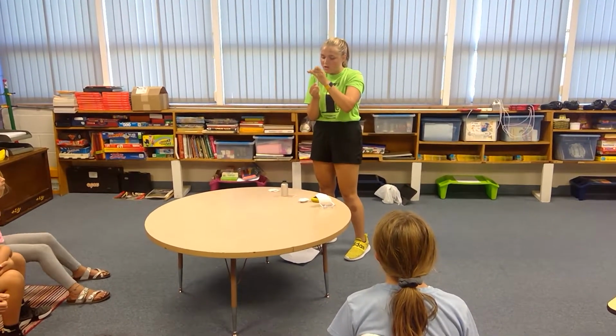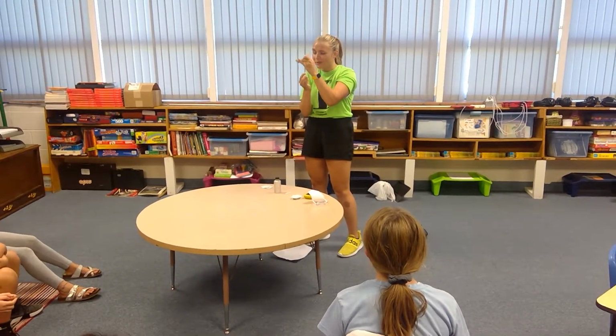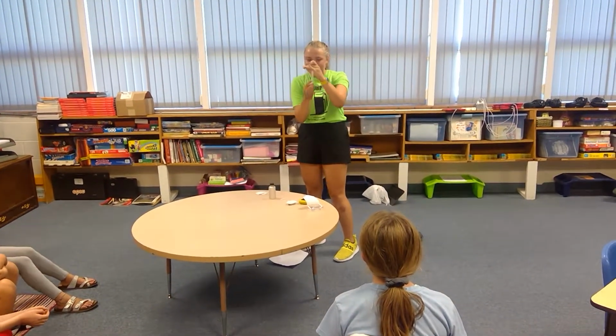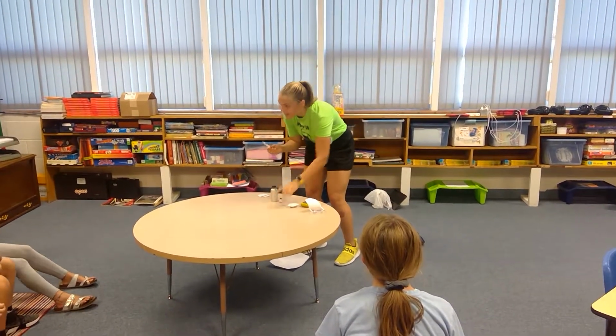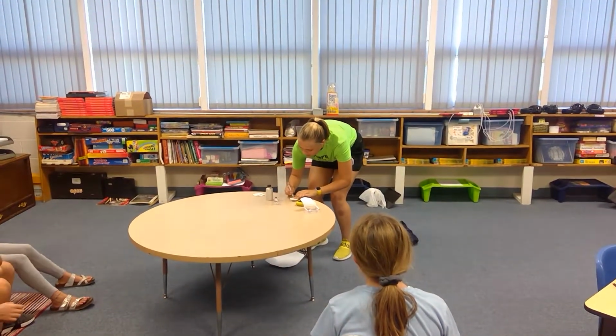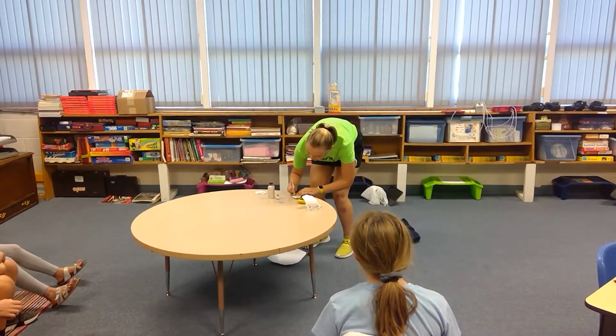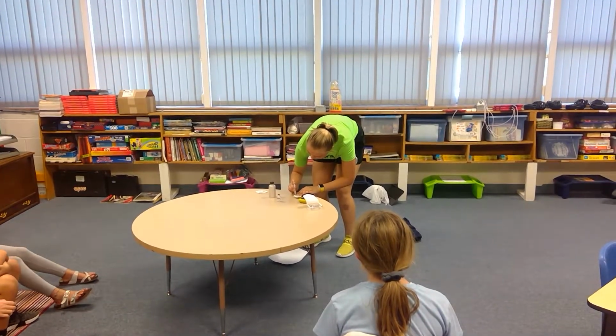And the reason I have to be super careful about how much, this is 1,000 units, and this is 3 days. You guys see how little that is? It's not very much at all. So to make sure it's really accurate in the pod. Next, really slow and steadily, I'm going to insert it into this little spot, so none leaks out and no bubbles are put in it.